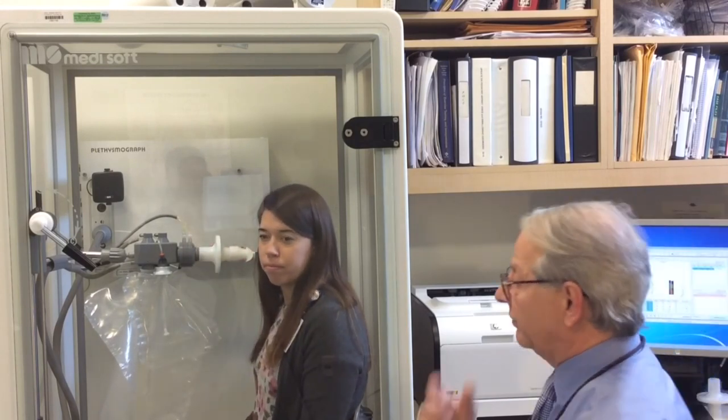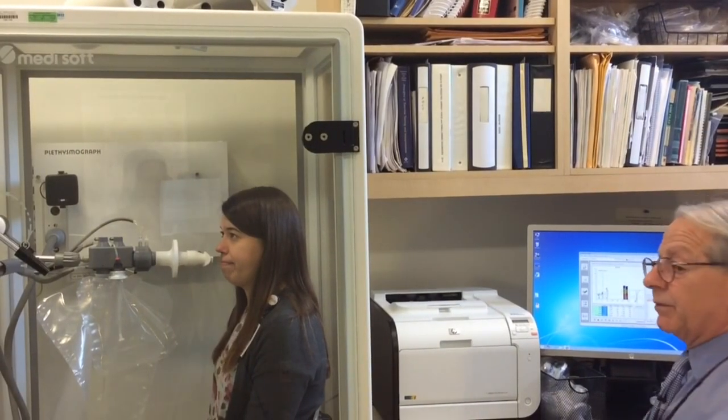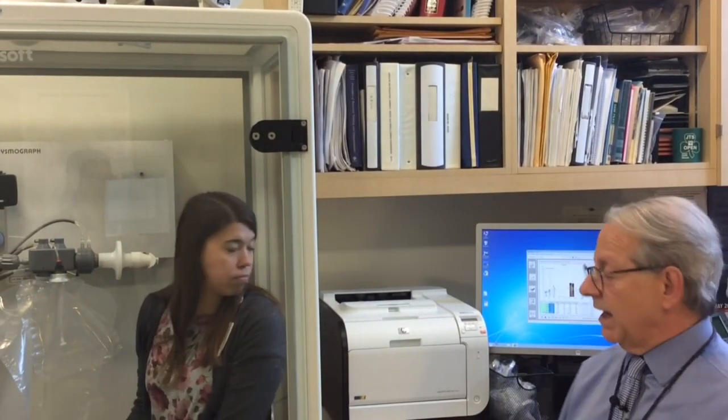All right. So we'll look at those numbers and see. And then in this particular point, we'll repeat the test again to meet American Thoracic Society standards for reproducibility and acceptability.